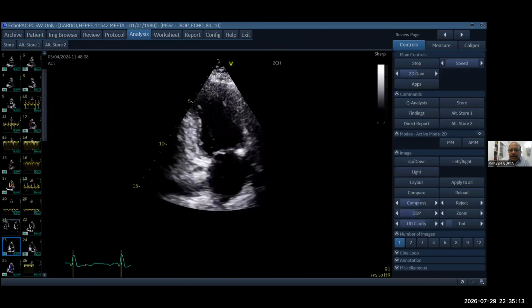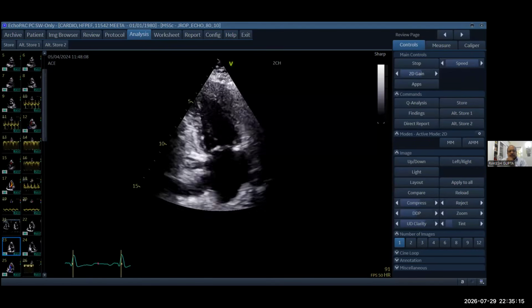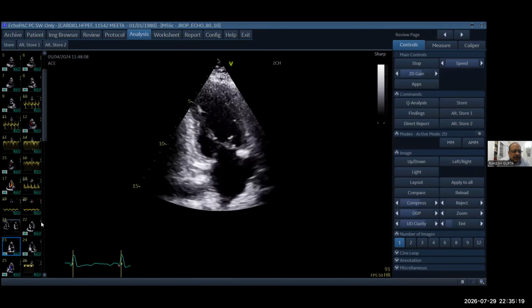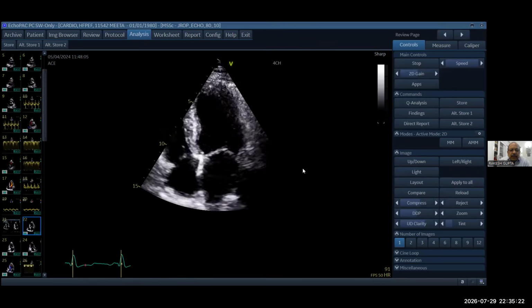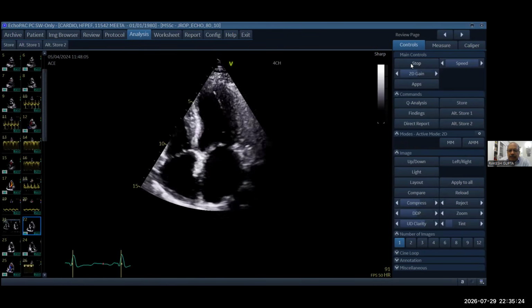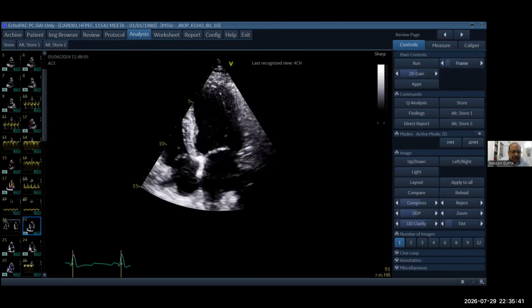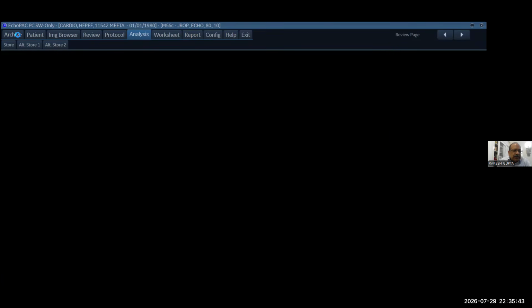Now see normal images. So I'm going to calculate ejection fraction in this subject. I'll ask the machine to stop. Now scroll to end diastole or beginning of systole. I'm going to look at this red cursor, it will go towards over here. So I'm going back. This is maximum LV size, but unfortunately this is not the correct picture.